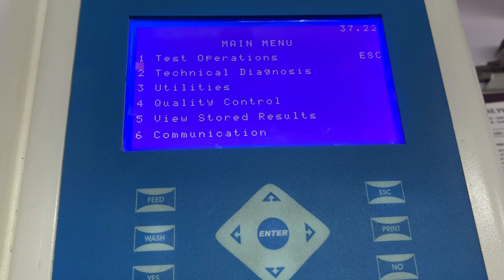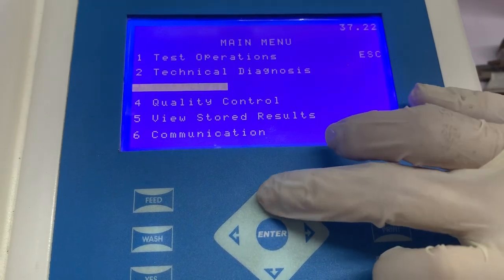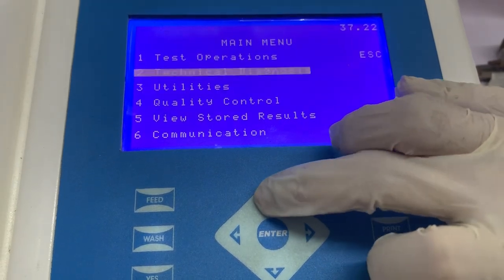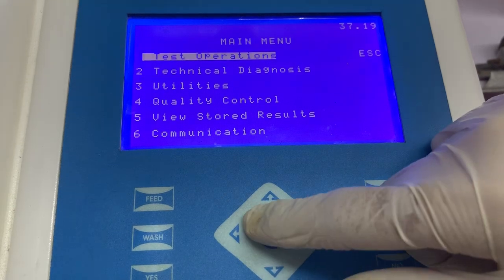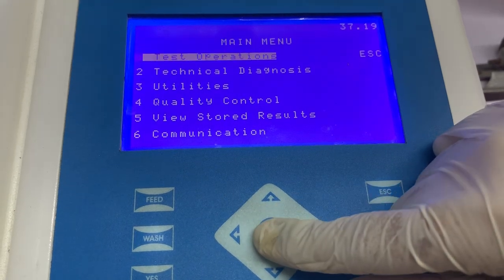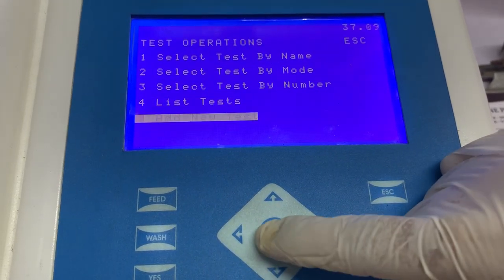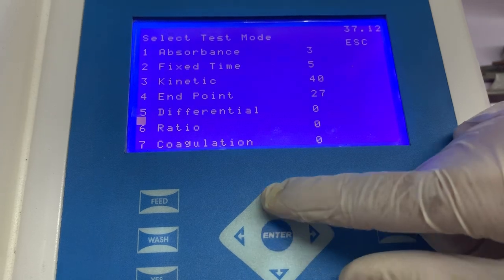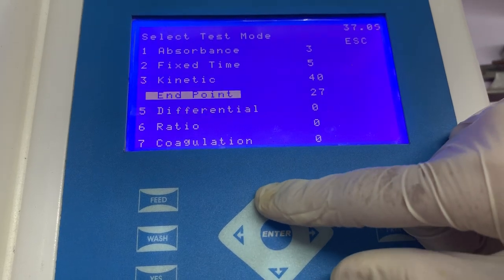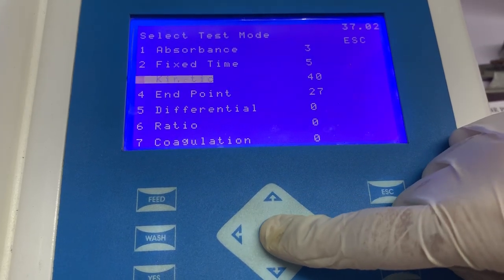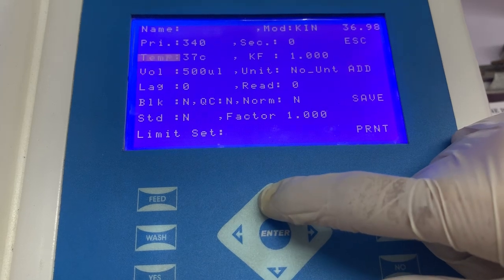The first thing we need to do is switch on the instrument and come to the main menu. Once we are at the main menu, select test operations and then select add new test. Here multiple options are available, in which we have to select kinetic because alkaline phosphatase is a kinetic parameter.